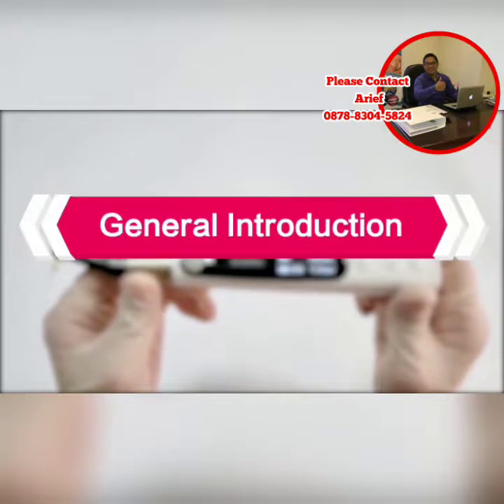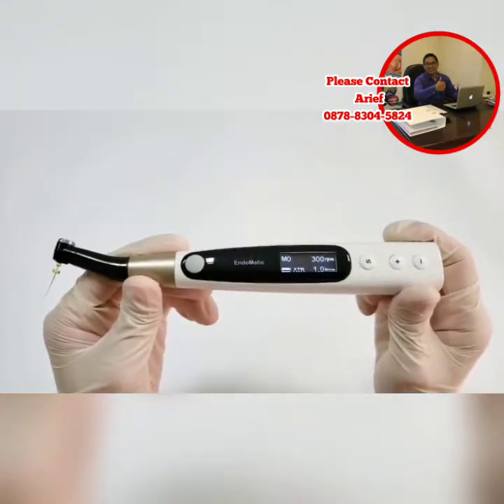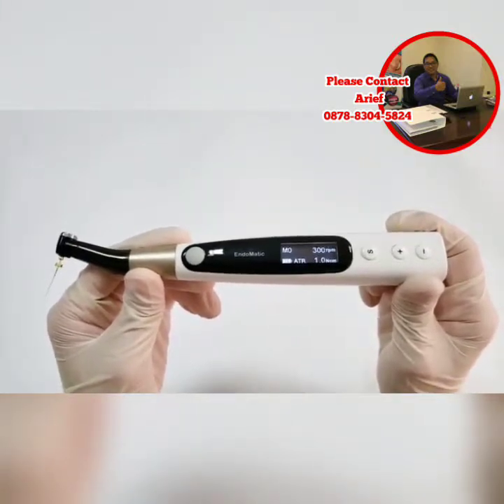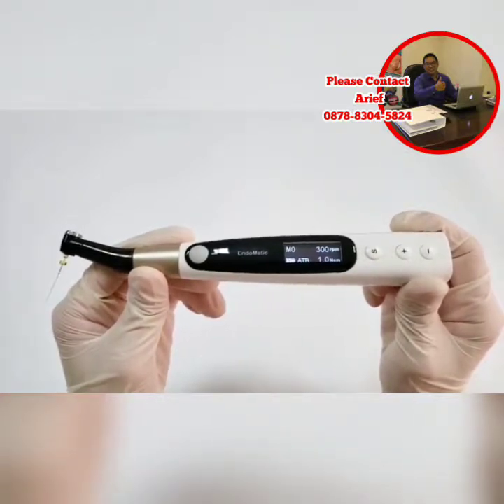Hello everyone, today I would like to introduce Woodpecker's new endo motor, EndoMatic, to you. EndoMatic is a full functional endo motor. For example, it's integrated with apex locator function and presents all market famous file systems inside.